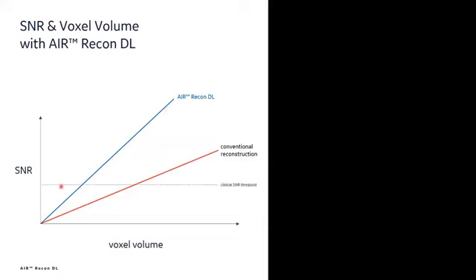All of the sites will have a clinical signal to noise ratio threshold. Something below it, they won't accept, but as long as the SNR is above it, then the site is happy. But of course, all of the sites also have a clinically acceptable voxel volume threshold. Anything higher than that voxel volume is unacceptable, and anything lower is acceptable.